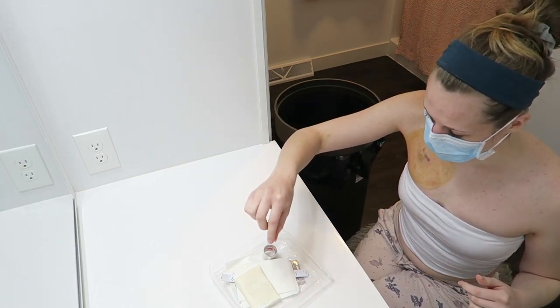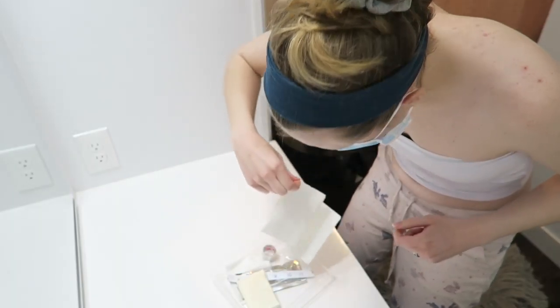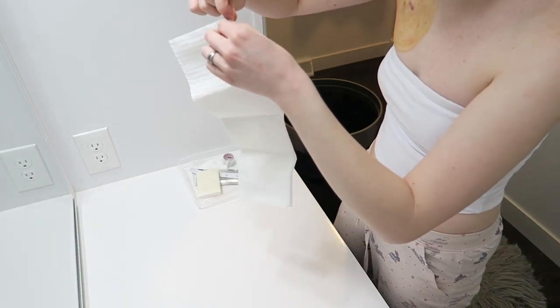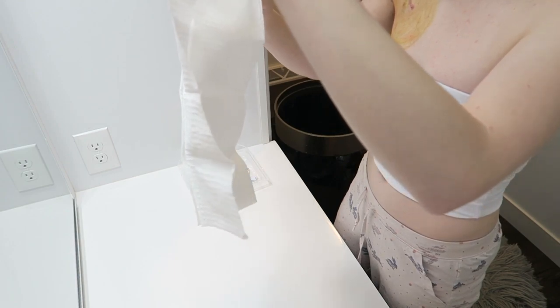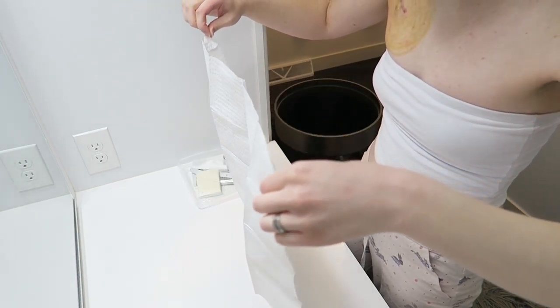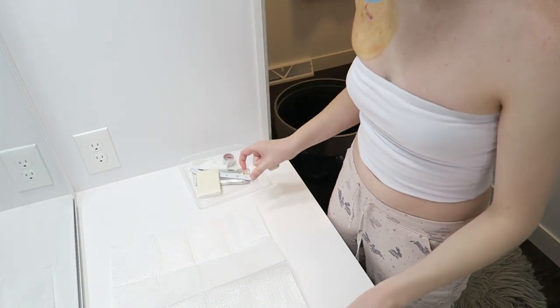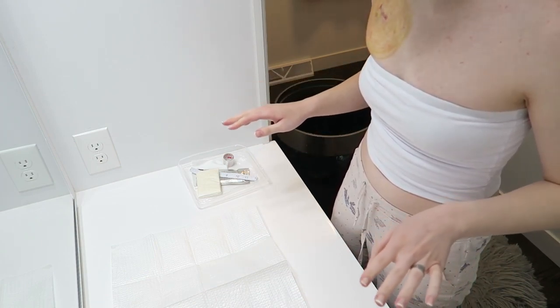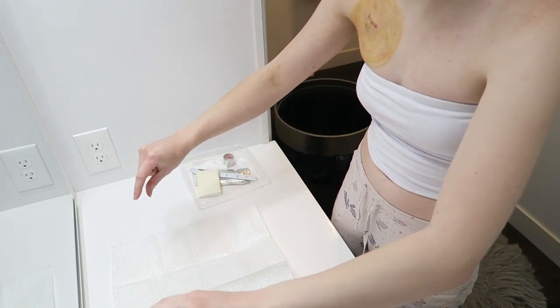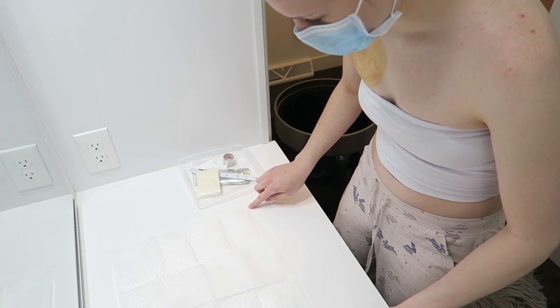Then you can go ahead and pinch your sterile field, which is this white thing right here. And then we're gonna push this over to the side. You're gonna open it up. Don't ever shake it to open it. And then you're gonna put the shiny side up. There's always a 1-inch barrier around the sterile field that you can touch, because that 1 inch around the border is not sterile. So you never wanna put anything sterile on the 1-inch border.